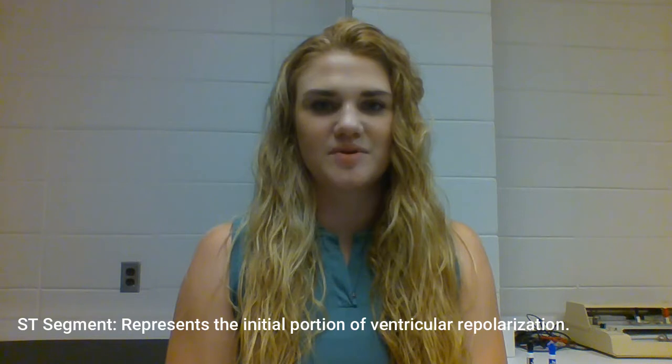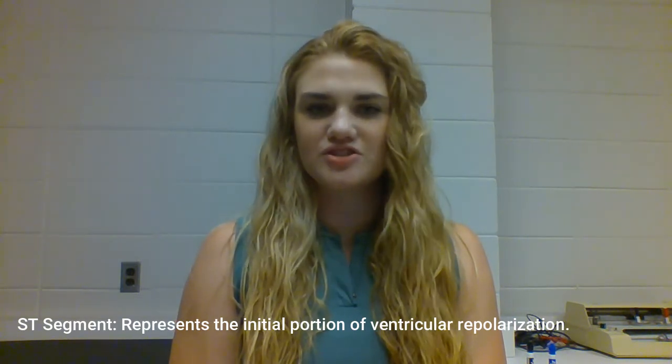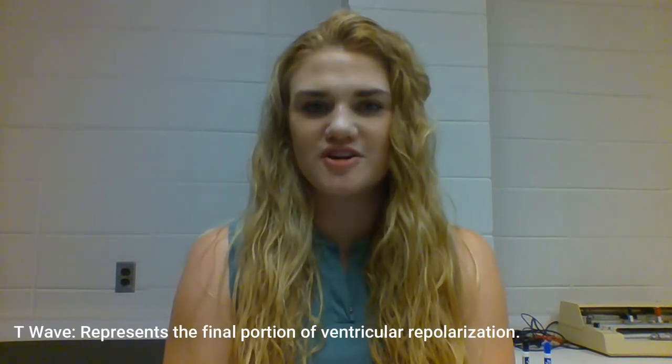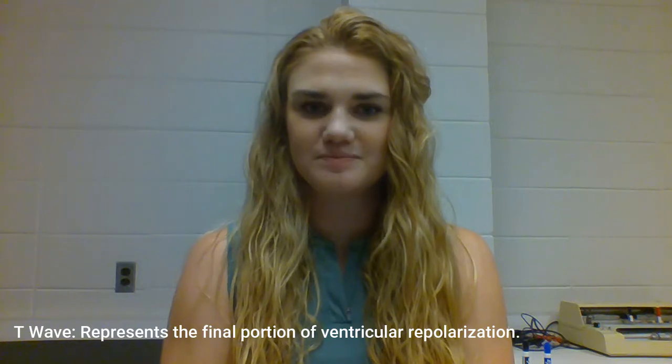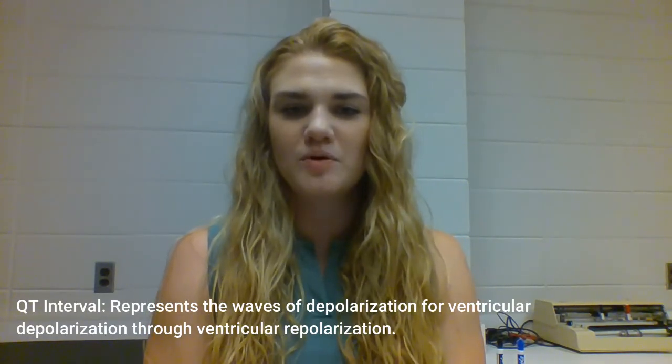Next is the ST segment. The ST segment represents the initial portion of ventricular repolarization. In a normal functioning heart, the ST segment should be flat with the isoelectric line, or at least within 1 millimeter of elevation or depression. The T wave represents the final portion of ventricular repolarization. And the QT interval represents waves of depolarization from ventricle depolarization to ventricle repolarization.